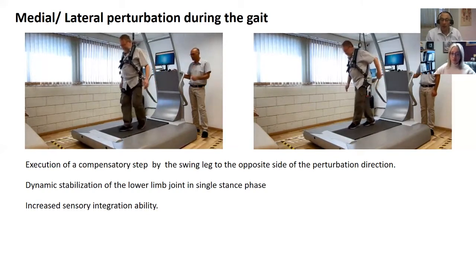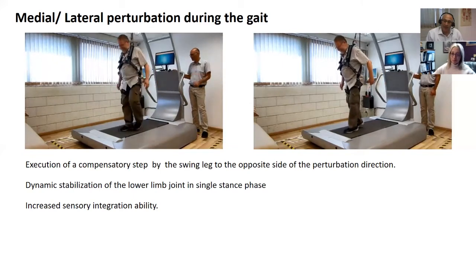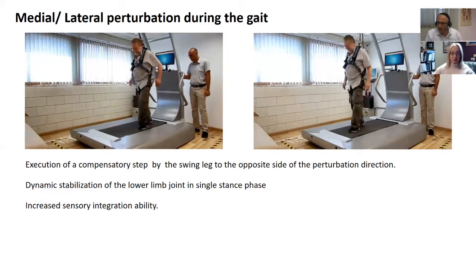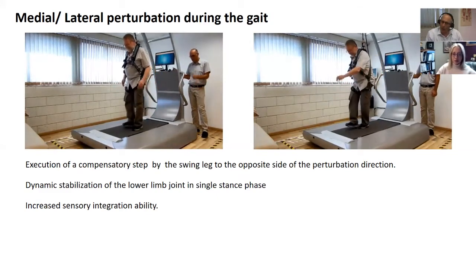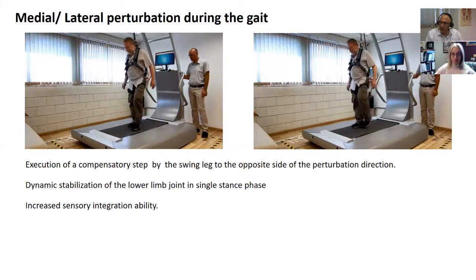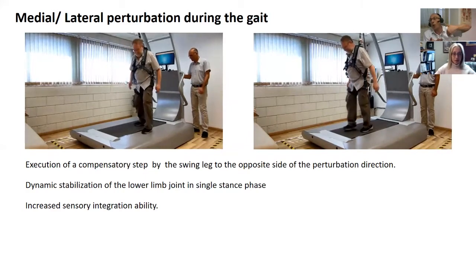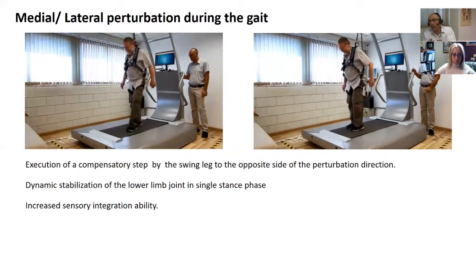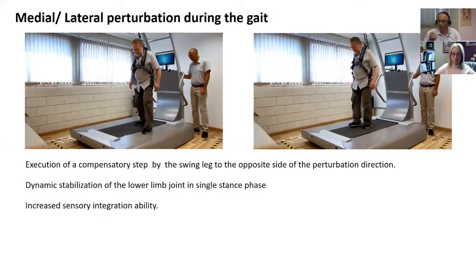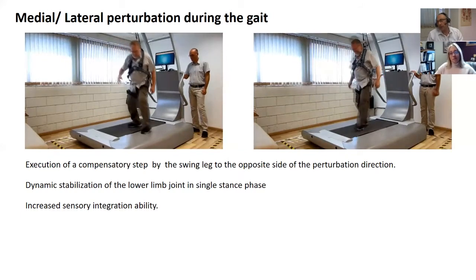That's right. Something quite interesting, and we can discuss this because it just came through my mind, is that it's actually a series of reactive steps, okay, isn't it really? There's a first, second, third, and that's exactly when I think we showed that CCTV image of when that patient had a collision, that the first step wasn't good enough, and he's only got a finite amount of time to attempt the second step or to attempt the third step, and then he's on the floor. Correct. So here you're training him to, as quick as possible, attempt the second and a third step. So that's something that's just come through my mind.